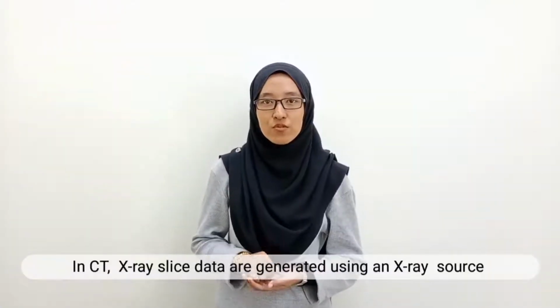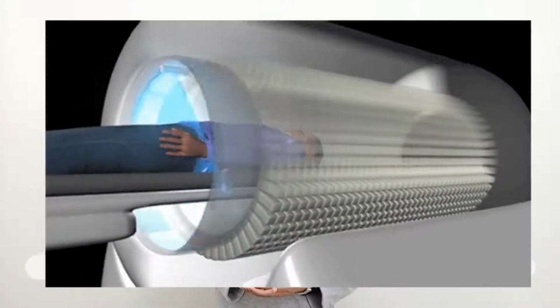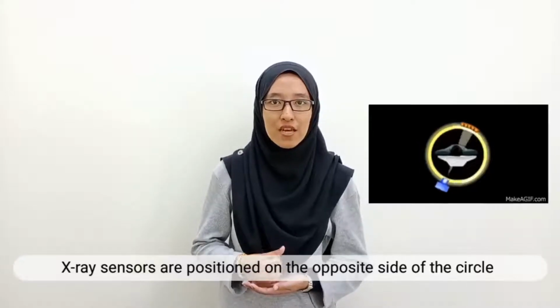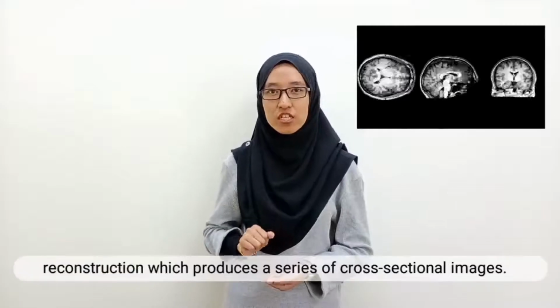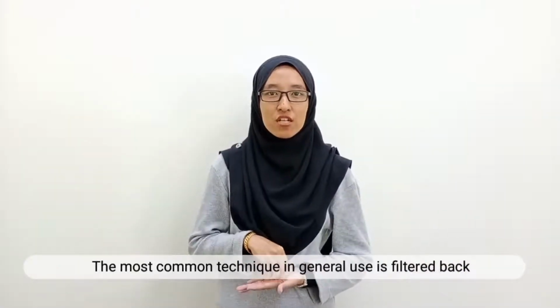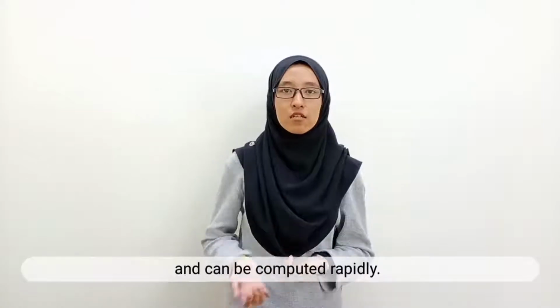In CT, X-ray slice data are generated using an X-ray source that rotates around the object. X-ray sensors are positioned on the opposite side of the circle from the X-ray source. Once the scan data have been acquired, they must be processed using a form of tomographic reconstruction, which produces a series of cross-sectional images. The most common technique in general use is filtered back projection, which is straightforward to implement and can be computed rapidly.